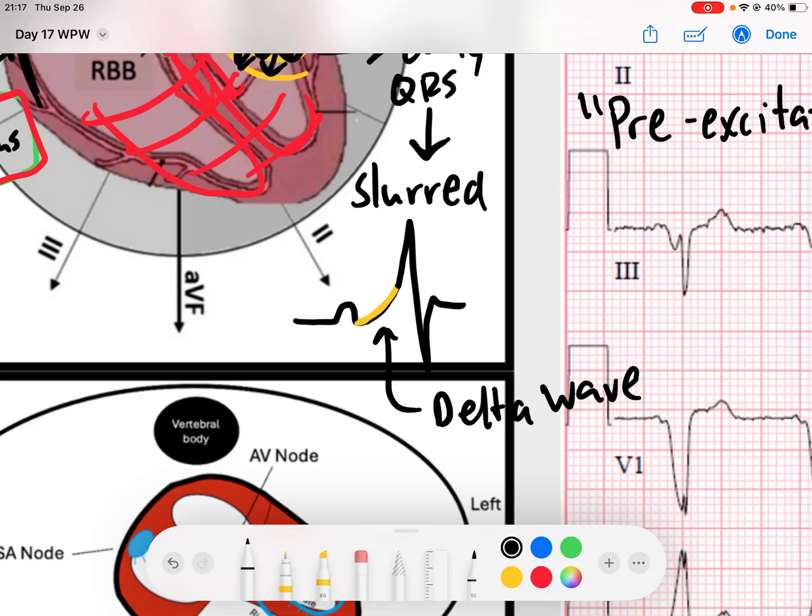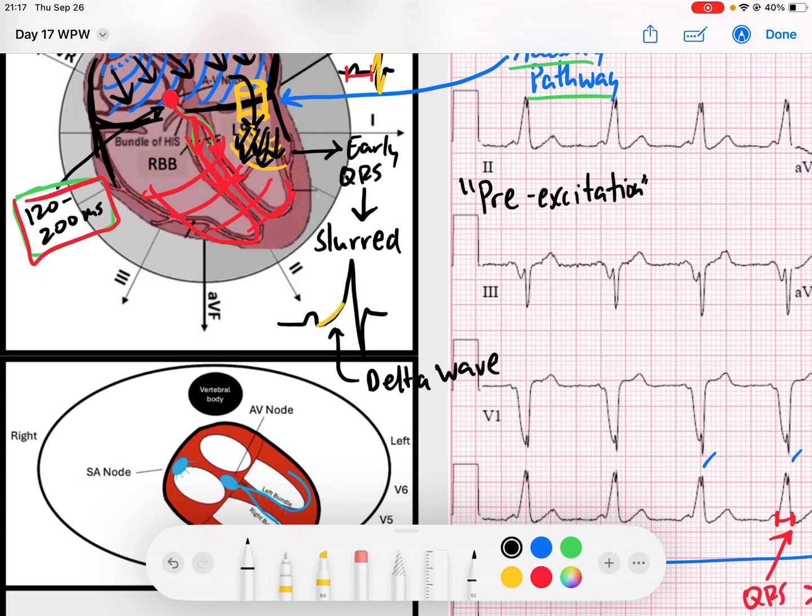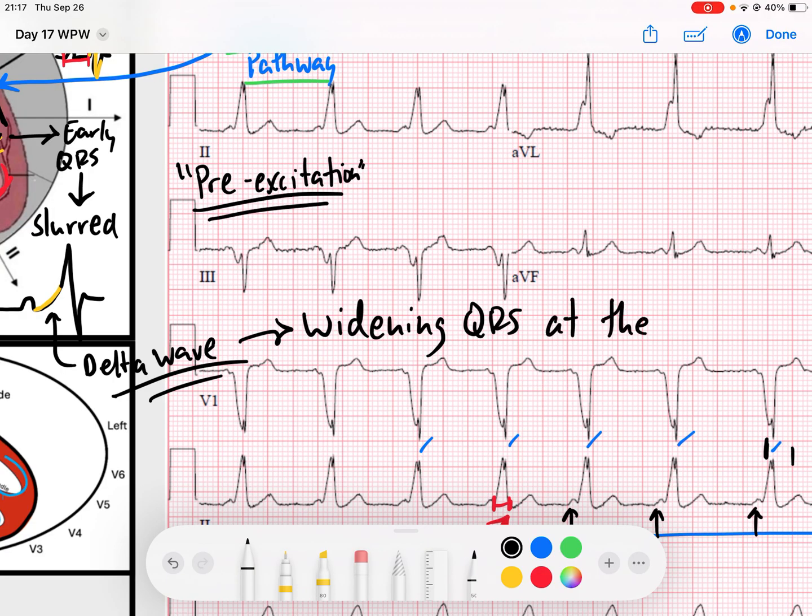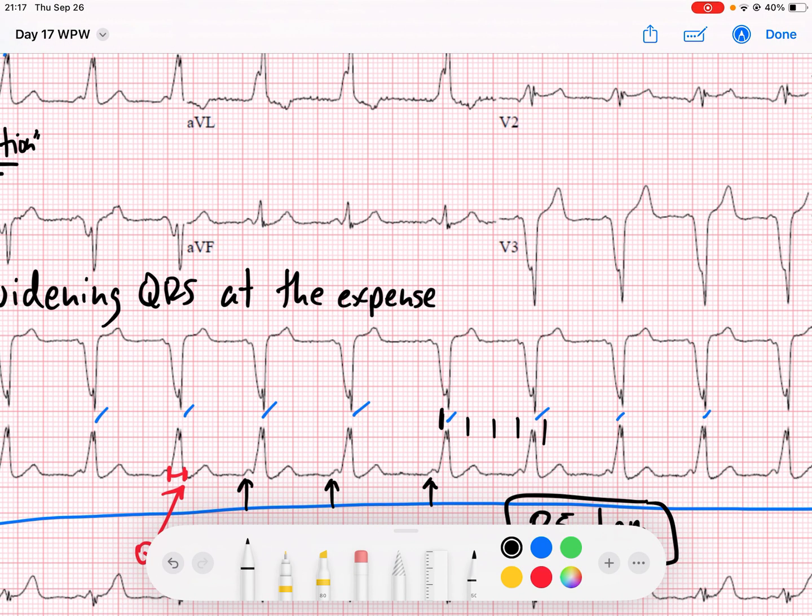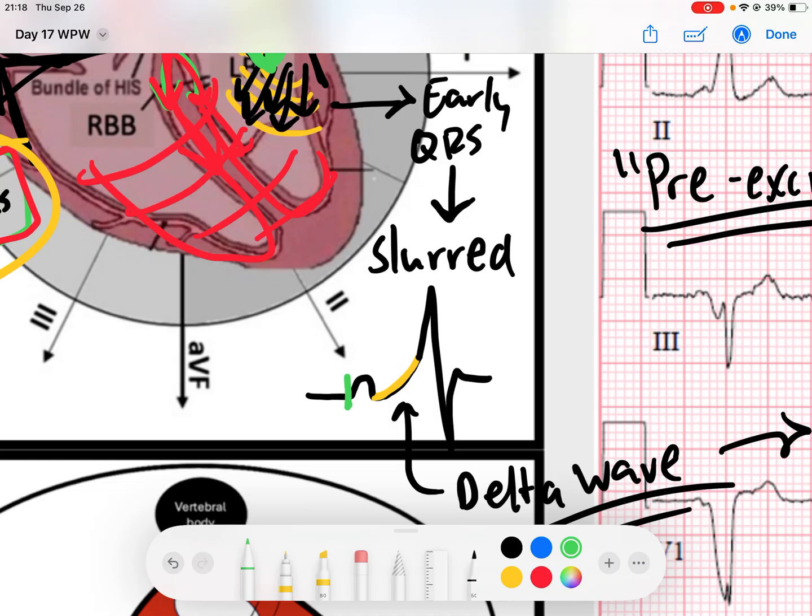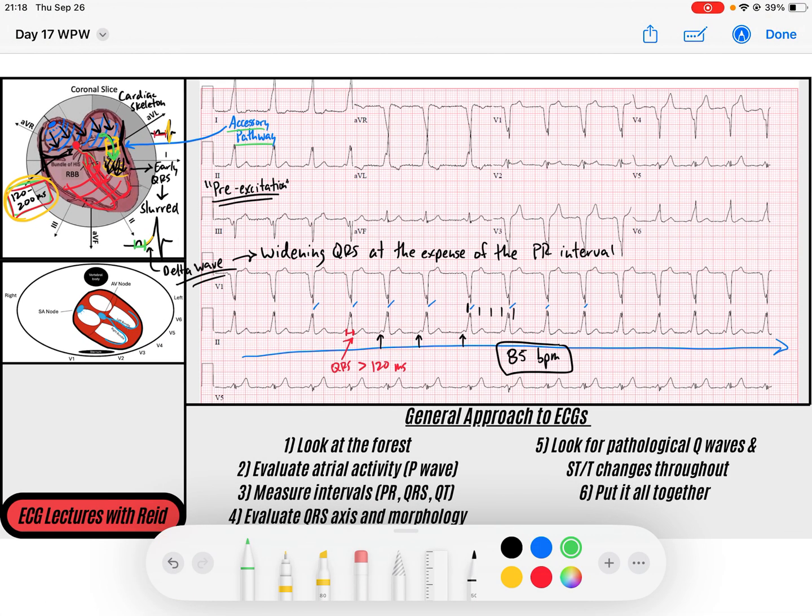So what do we get in Wolf-Parkinson-White? We're going to have sinus rhythm. We're going to have a delta wave representing ventricular pre-excitation. And what's that going to cause? That's going to cause widening of the QRS. But at the expense of the PR interval. This is a really important concept. Because remember, the PR interval is representing AV delay by 120, 200 milliseconds. But we're actually getting forces that are slipping around that AV delay. So my PR interval is, look how shorter my PR interval is because of that delta wave. So we're going to get widening of the QRS at the expense of the PR interval.